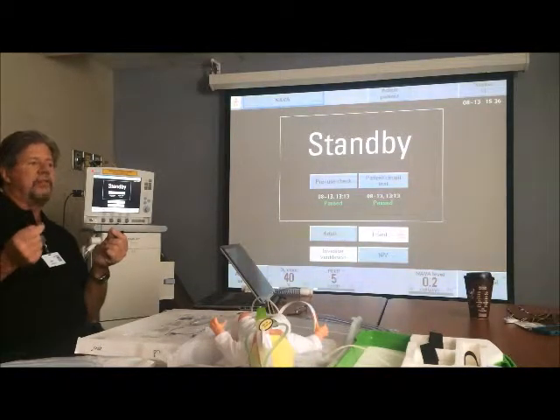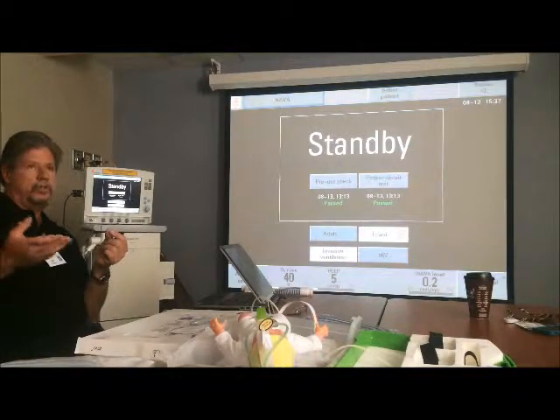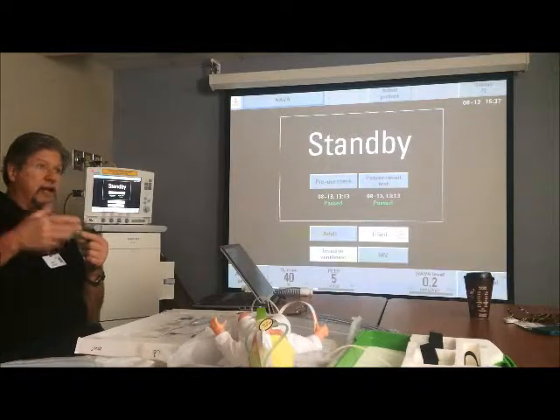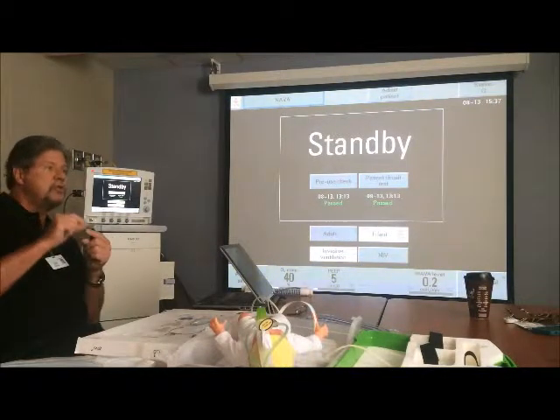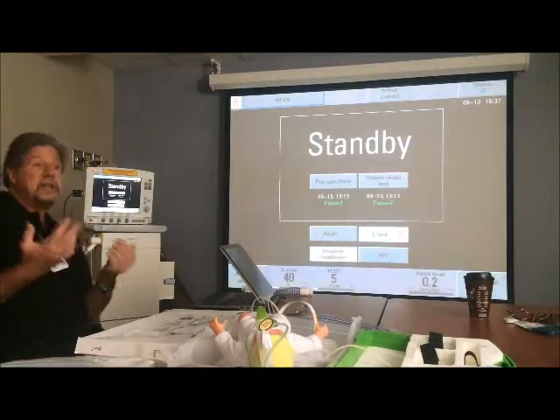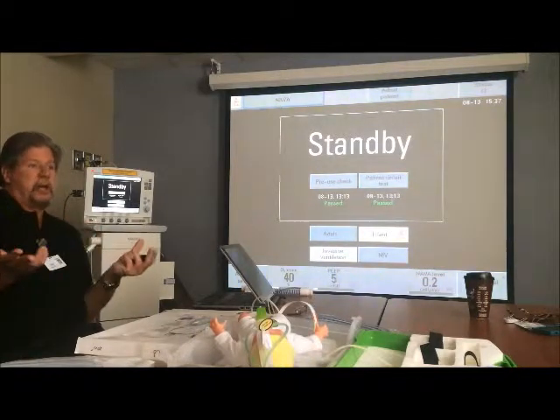What would you put the NAVA level at if the EDI was 100? Well, just from what I told you, you wouldn't put it at 1, right? Because 1 times 100 is 100 centimeters of support. That would be outrageous. So you go, well, I'm going to put it at 0.1, or let's say 0.2. 0.2 times 100 is 20 centimeters of support. So for that COPD patient at that time, 20 centimeters of pressure would probably give him some reasonable tidal volume.